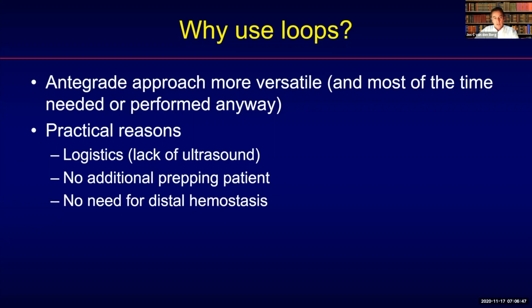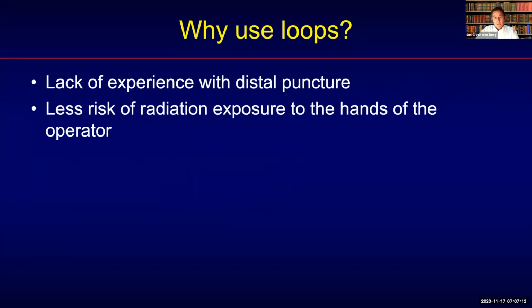You may not have ultrasound in your lab for one reason or another in order to perform this distal puncture. You don't need additional prepping of the patient, and sometimes you have not discussed the distal approach with the patient when obtaining the informed consent. And one of the other reasons is that you don't need distal hemostasis if you use the loops. Then you may not have experience with distal puncture, which is hampering the approach.